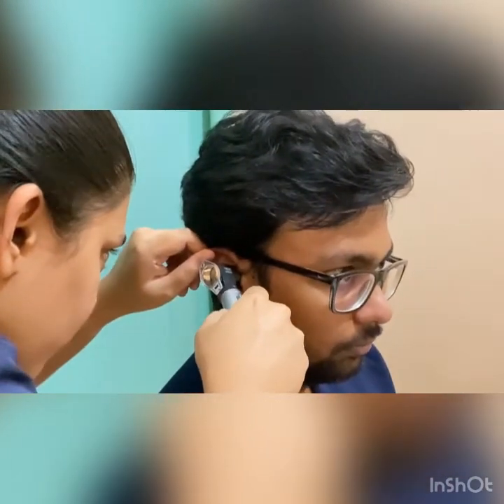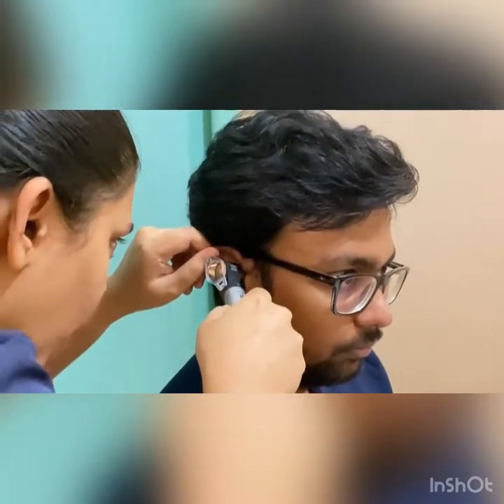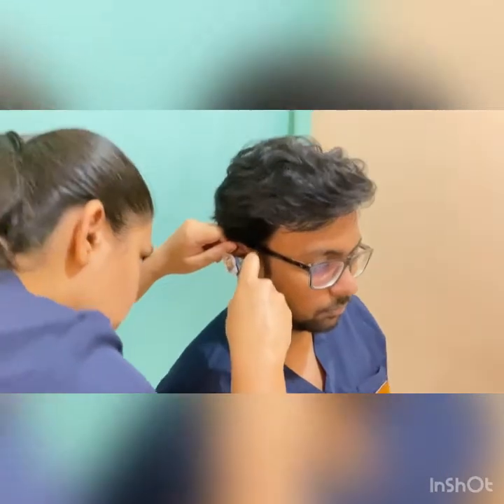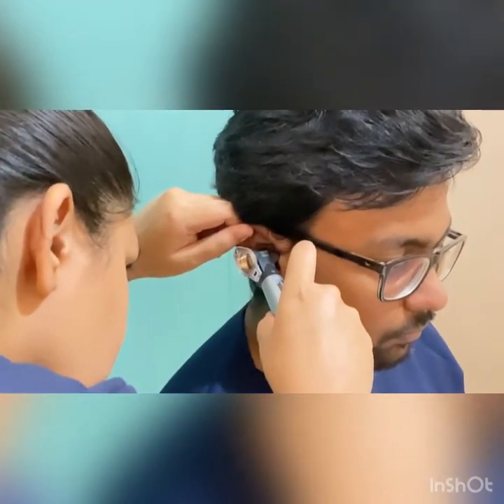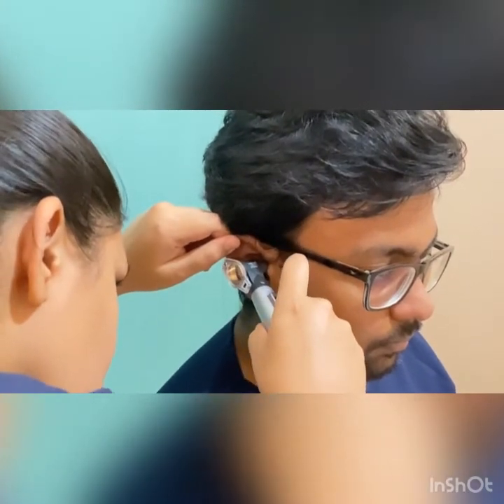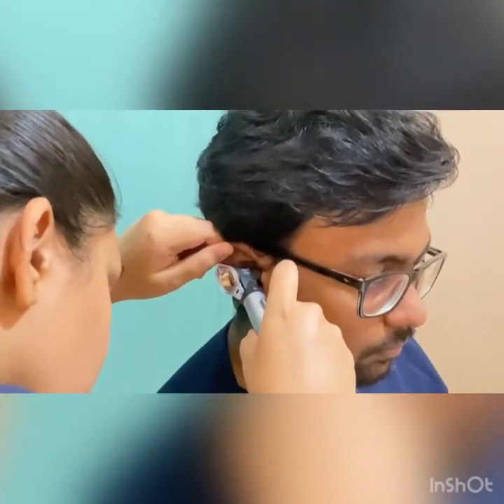Move the otoscope downward and forward. Inspect the ear canal, noting any discharge, foreign bodies or redness of the skin. Inspect the eardrum, note its color and contour. Also, identify the handle of the malleus.